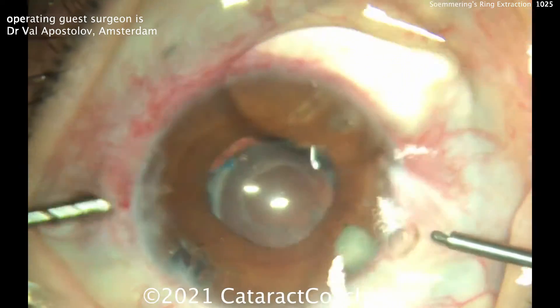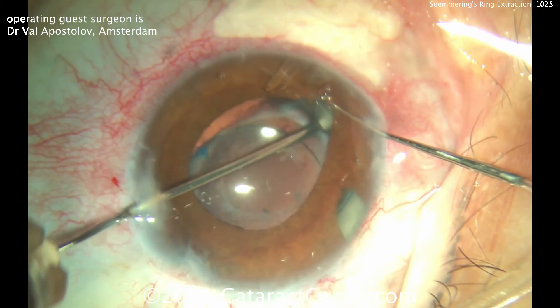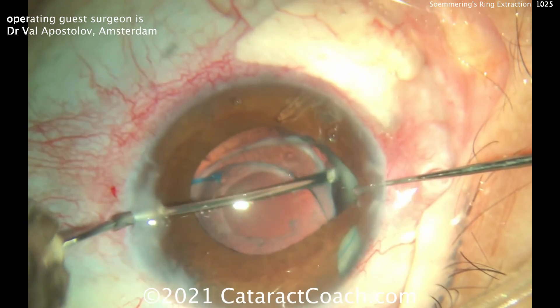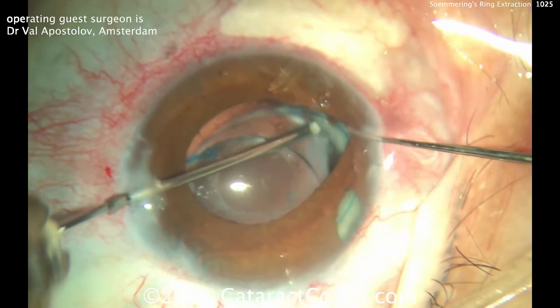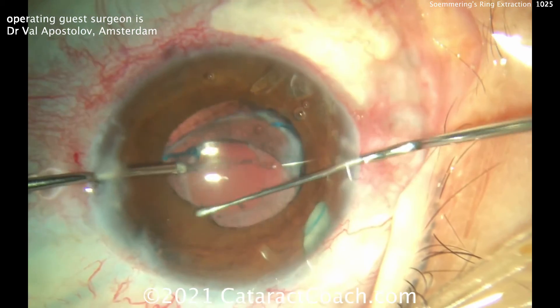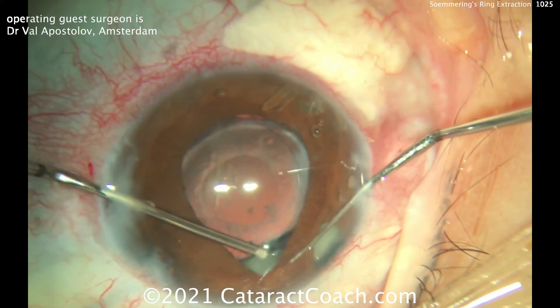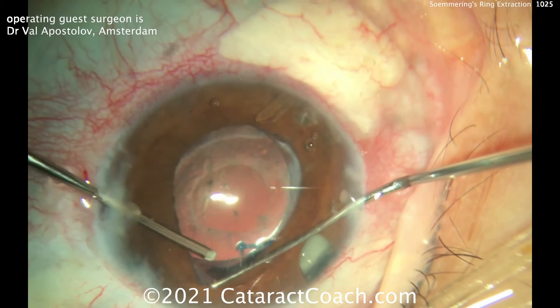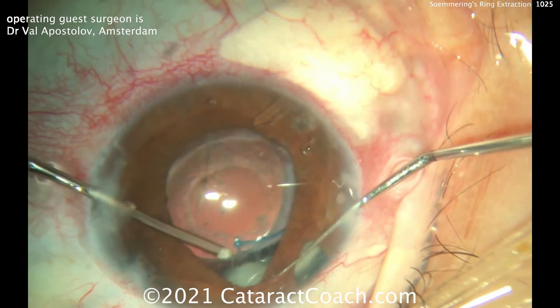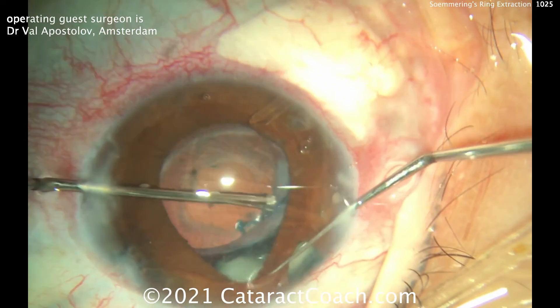That looks great — and remember, that's only half of it. Look through that peripheral iridotomy on the bottom right. He's going to go back in and do a little more dissection, using these instruments to free it up and loosen it from the adhesions. You want to be careful not to damage the capsular bag. He's going to get the other half of this Soemmering's Ring out. There's that huge Soemmering's Ring — he's just going to bring it up and use the same technique, loosening it up quite nicely.